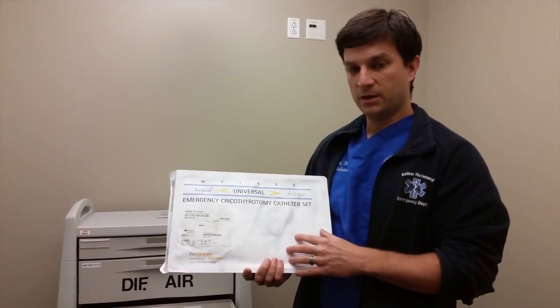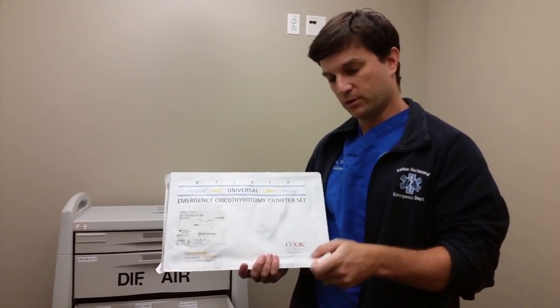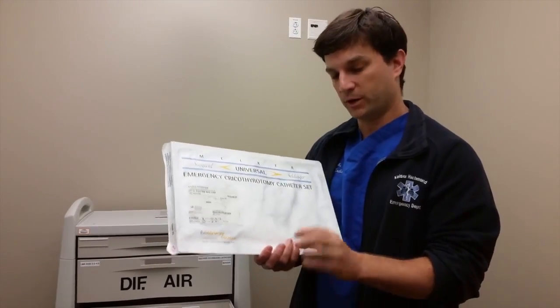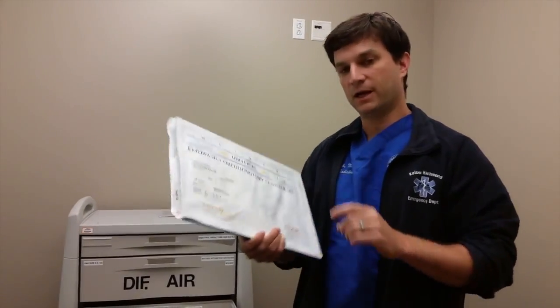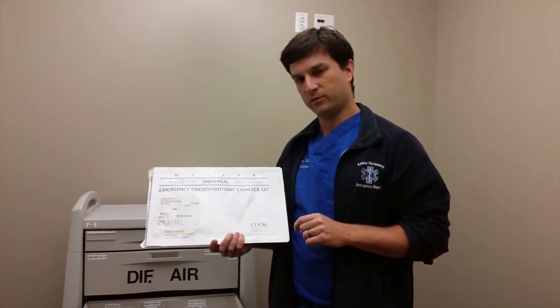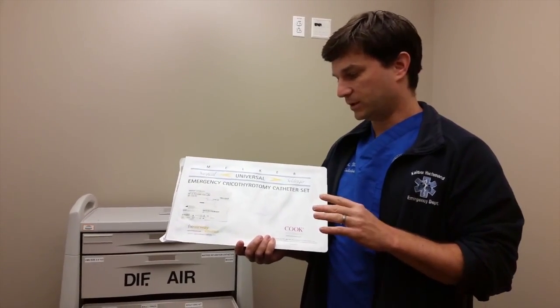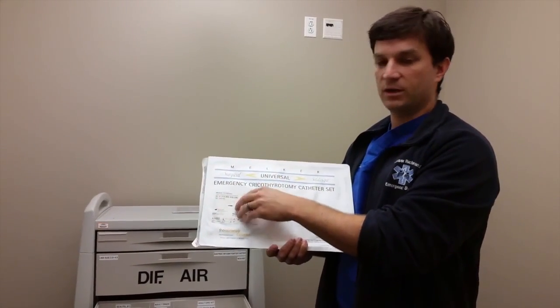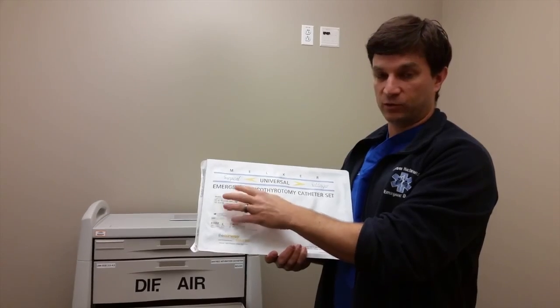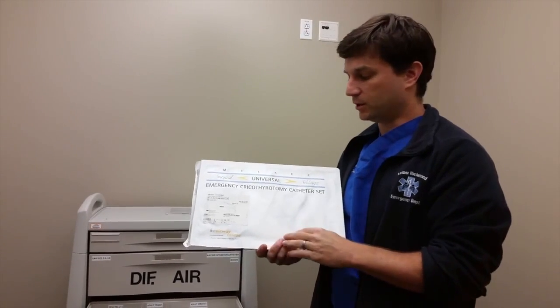And the Seldinger pathway is a percutaneous approach where you would put in a catheter over a needle, where you would aspirate into the trachea through the cricothyroid membrane, pass your catheter in, put a wire in, take the catheter out, leave the wire in, and dilate up just like you would for a central line. It's a little more time consuming though, so it's there for more of an elective kind of situation where you're not really in a crash situation where you need to get an airway quickly. More oftentimes, we're going to go down the surgical pathway, which is a scalpel and a tracheal hook and the actual cricothyrotomy tube, which is key there.